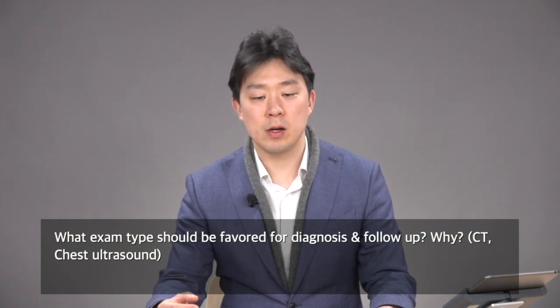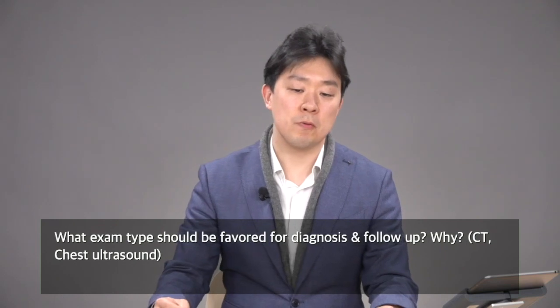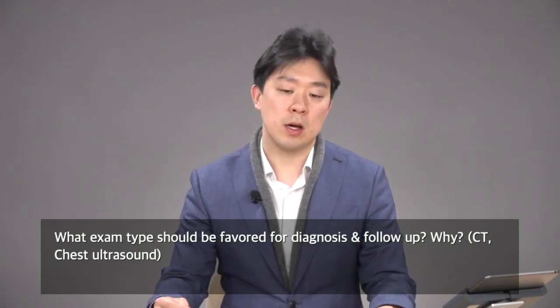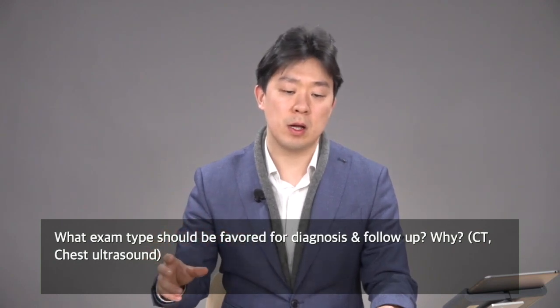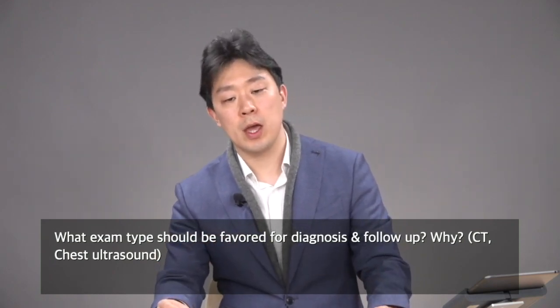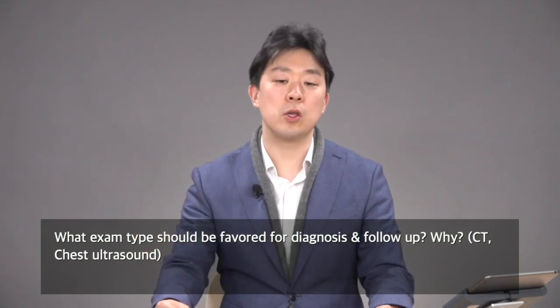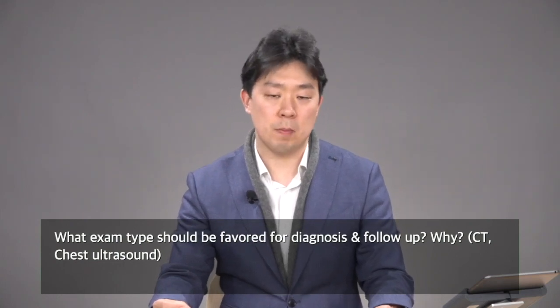And although chest ultrasound may be used for the imaging workup of COVID-19 patients, the current publications mainly handle preliminary observations on the use of ultrasonography in COVID-19 patients.